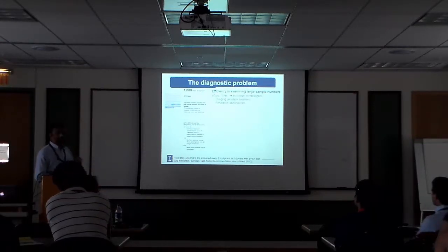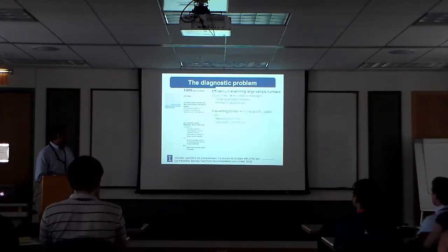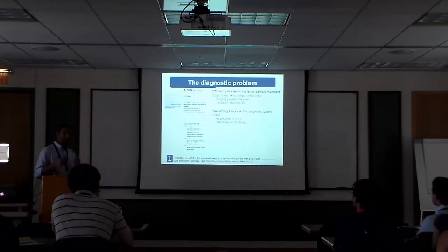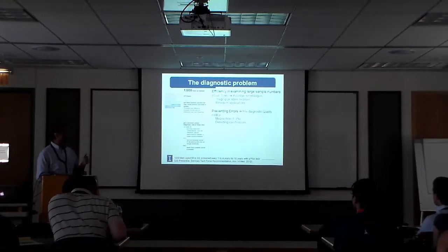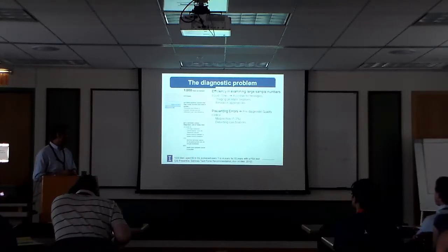Okay. So in my lab, we're trying to tackle these problems. The first thing we do is, can we have a technology that goes and tells people that, look, here you've got 100 cases of prostate cancer. We can do this very rapidly, and we don't need to spend human time looking at biopsies. The next case comes in distinguishing this group from this group. Could we diagnose whether there's a cancer or not? And can we do that with very, very high accuracy so that we can actually replace a human in some cases? In this case, it turns out that you need about a 1% error rate. Anything above that gets you into a territory which is uncomfortable for humans.